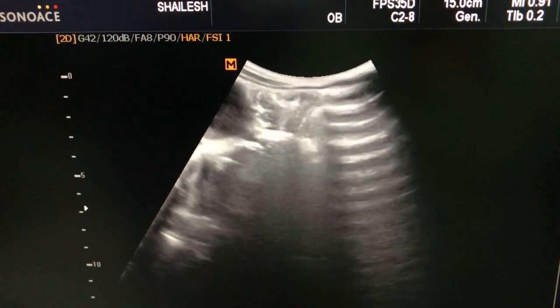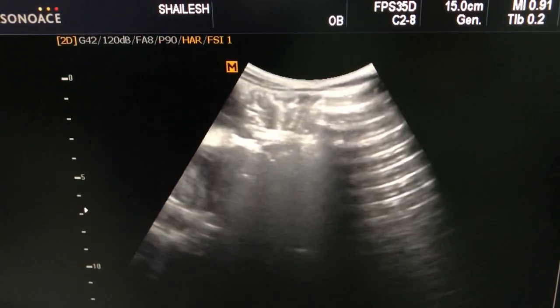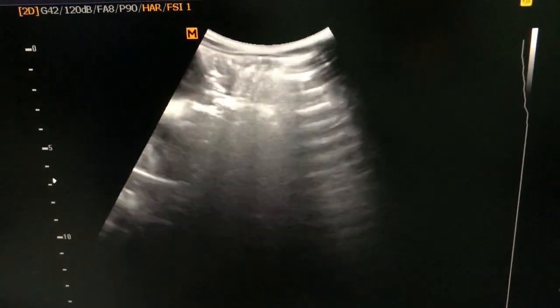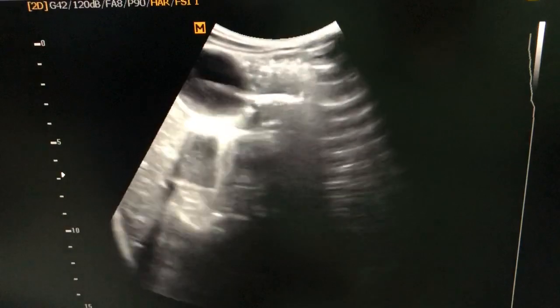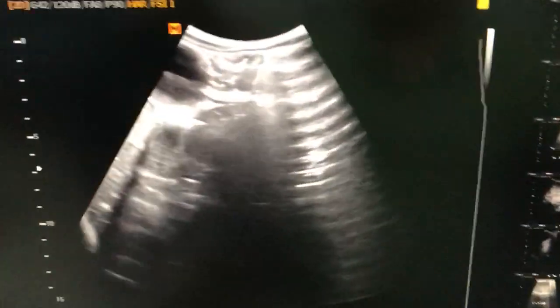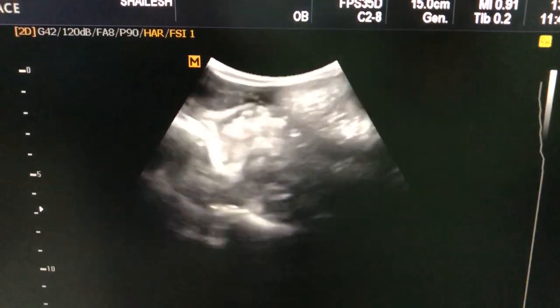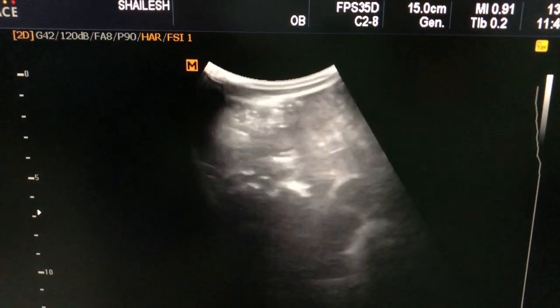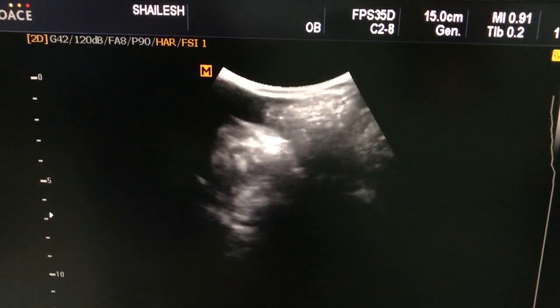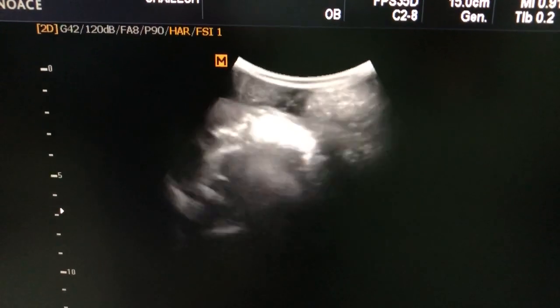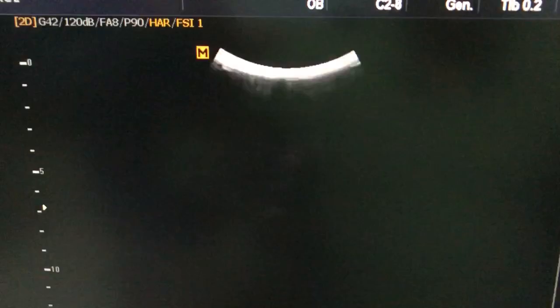This is a sign of gas inside the peritoneum. This is a typical feature of pneumoperitoneum by the convex probe. The probe is placed over here.